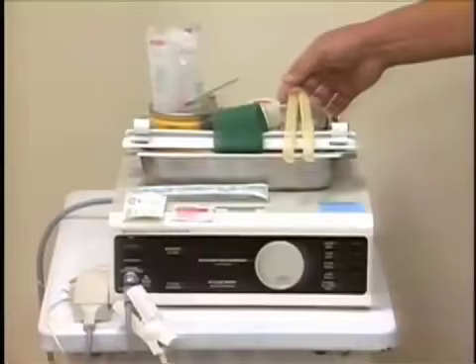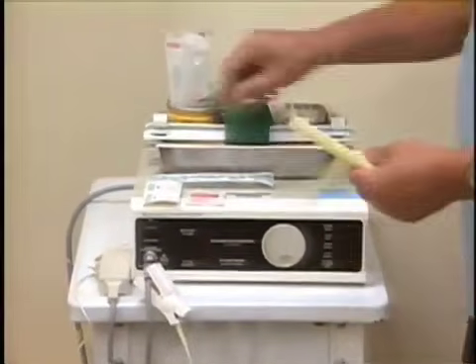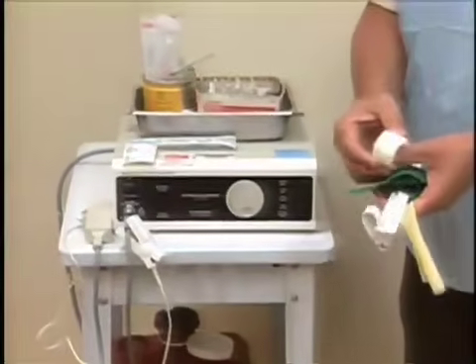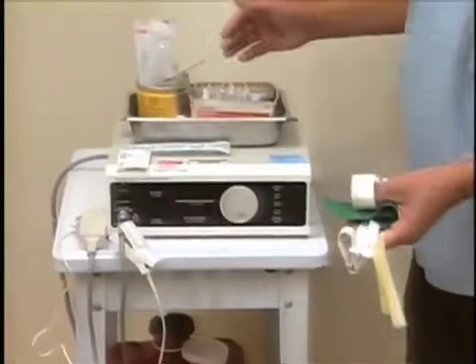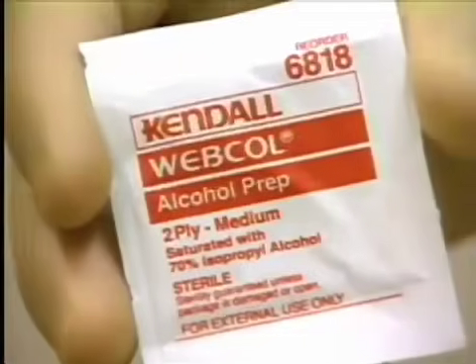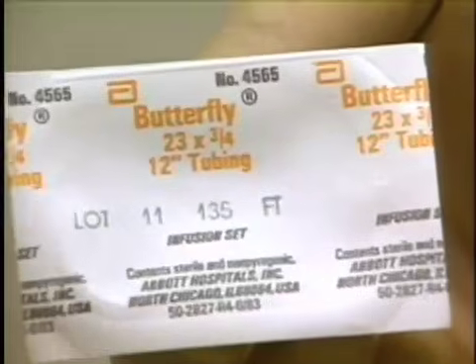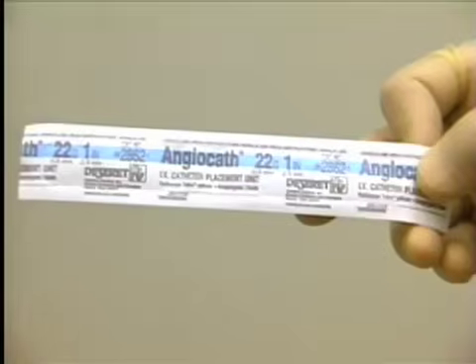The IV tray that we will have in each of the operatory will contain a tourniquet, an armboard, as well as the tape to fix the angiocath or the butterfly. We have sponges to cleanse the site of the venipuncture, and we will have the 23 gauge butterfly, as well as a 22 gauge angiocath to perform the venipuncture.